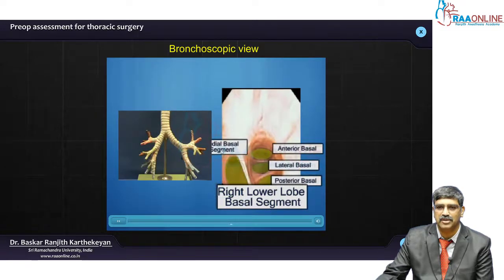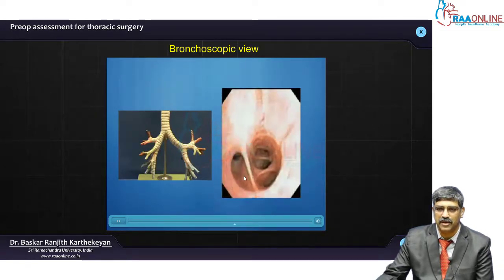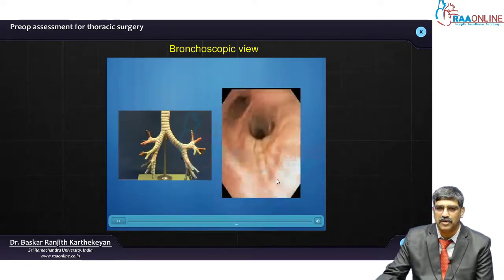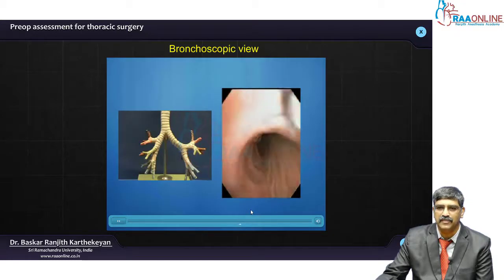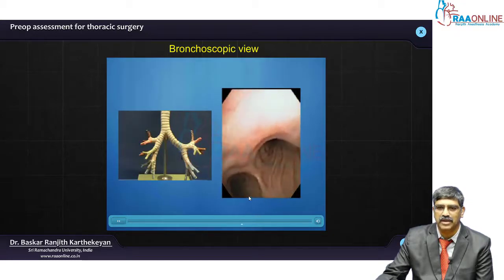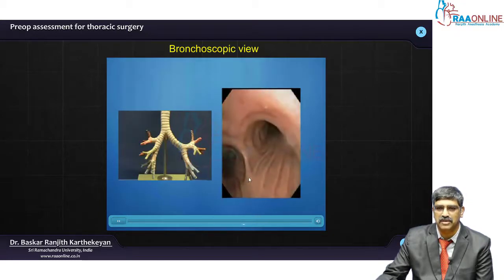The four basal segments are: anterior basal, lateral basal, posterior basal, and medial basal segment. Then you withdraw a little bit and go into the left main stem bronchus.